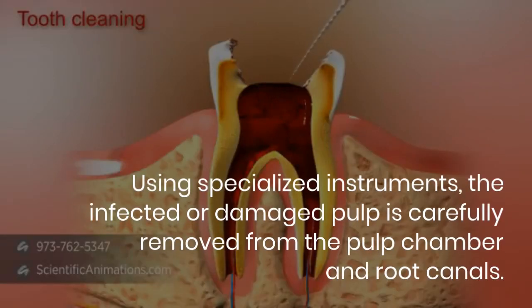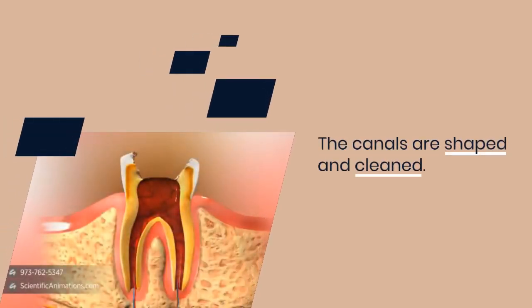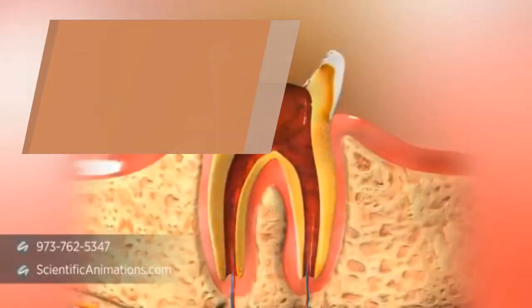Pulp removal. Using specialized instruments called files, the dentist or endodontist carefully removes the infected or damaged pulp from the pulp chamber and root canals. The canals are shaped and cleaned to eliminate bacteria, debris, and any remaining infected tissue.